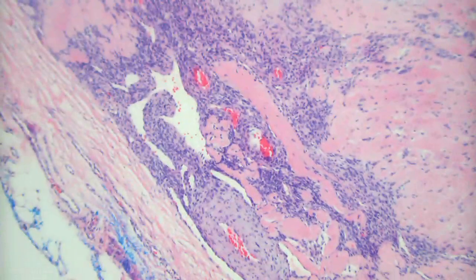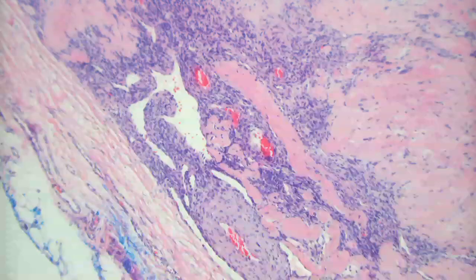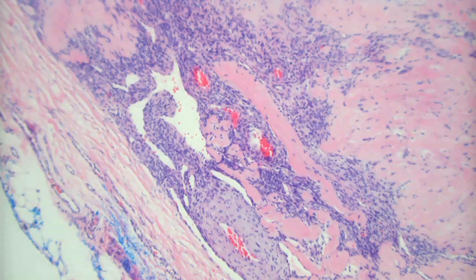So that's very good. So these are myofibroblasts, just like the fibromatosis we saw earlier. This thing's a little bit of a different animal because it's also got the vascular component to it. Sometimes you get lots of this and a little bit of this. Sometimes you get lots of this and very little of this. Sometimes you get a nice mixture of both like we see in this case.